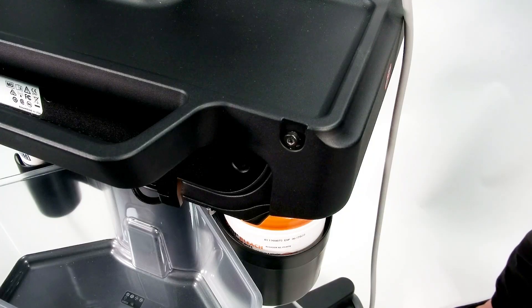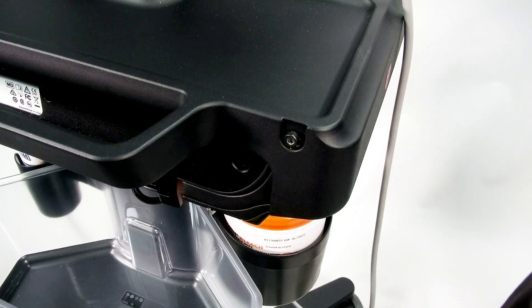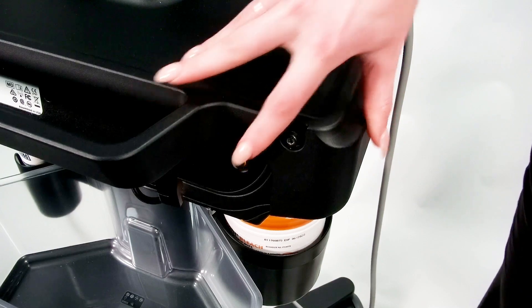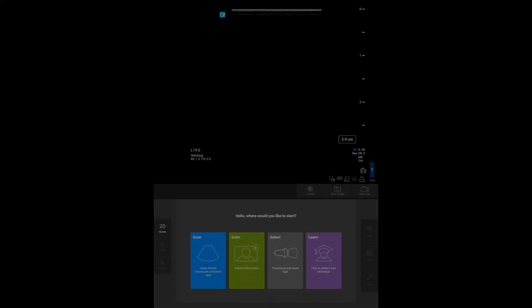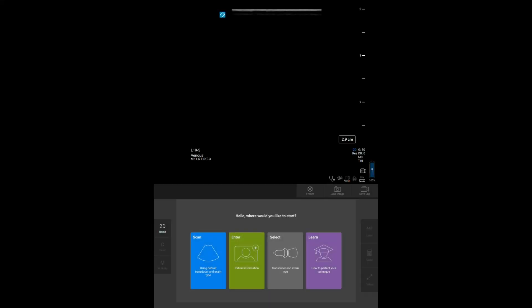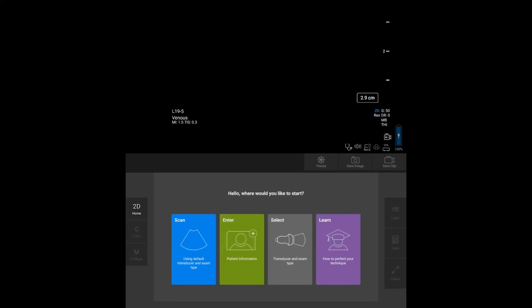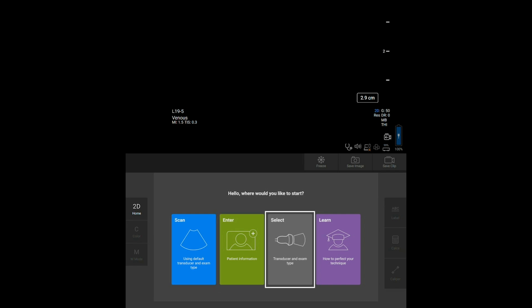To turn the system on, press the power button on the back of the machine. There are several available modules to accommodate your workflow. You can start scanning, directly enter patient information, begin with an exam type, or if you want to learn a procedure, access ScanAlong Educational Tutorials.